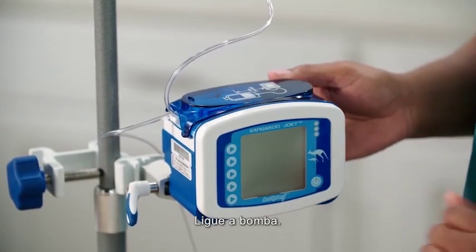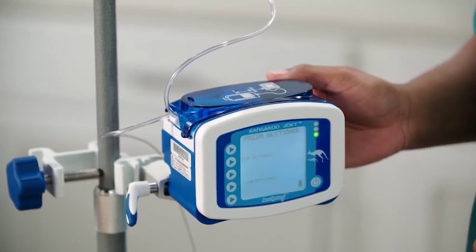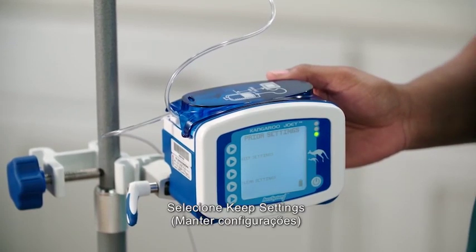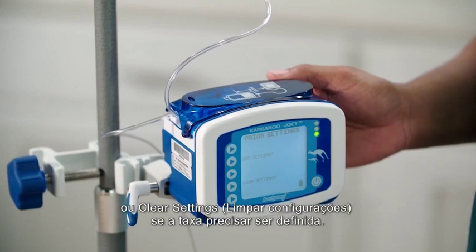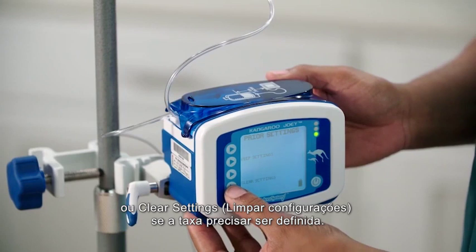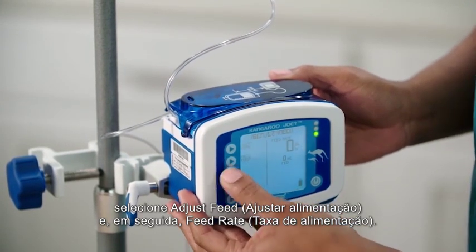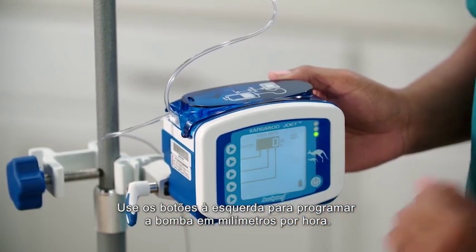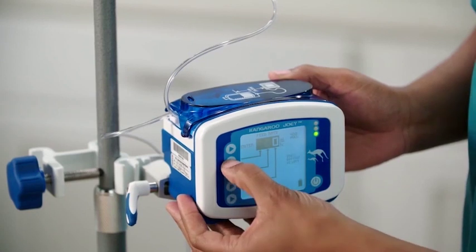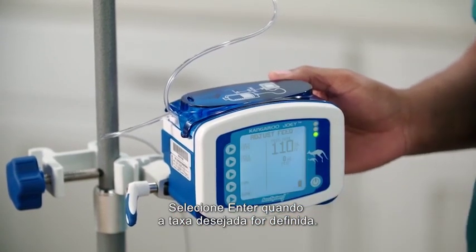Turn the pump on. Select 'keep settings' if the desired rate was previously set, or 'clear settings' if the rate needs to be set. To set the rate, select 'adjust feed,' then 'feed rate.' Use the buttons on the left to program the pump in milliliters per hour. Select 'enter' when the desired rate is set.